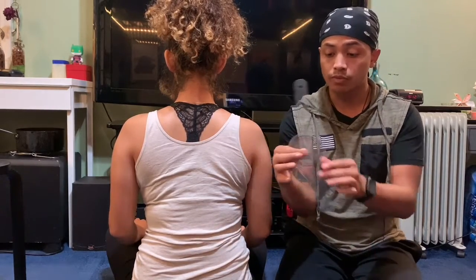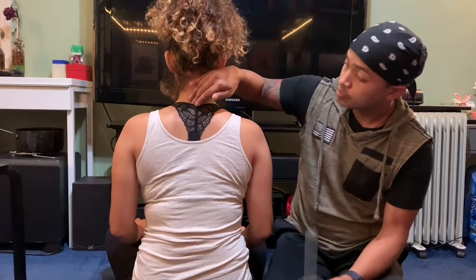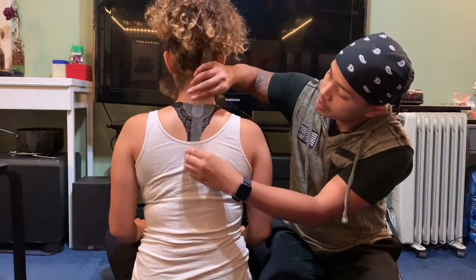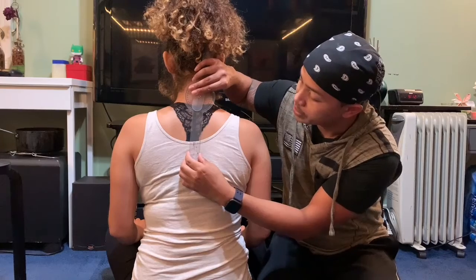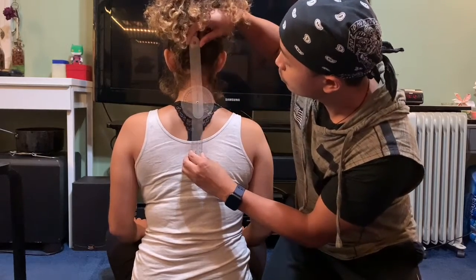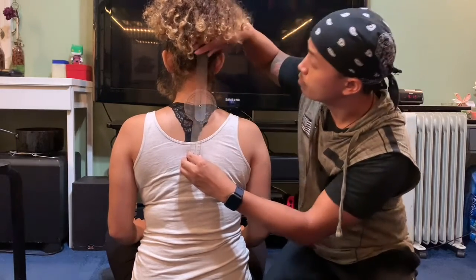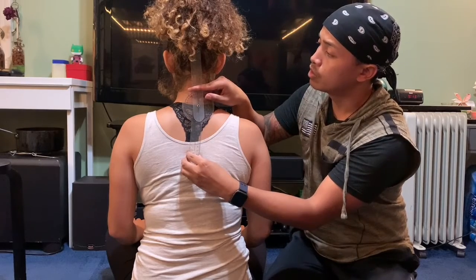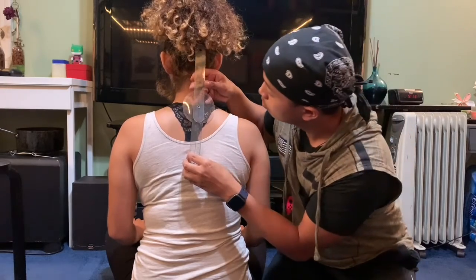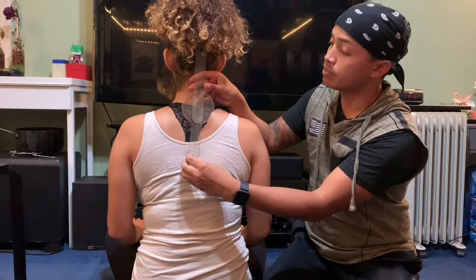I'm going to use this goniometer and I'm going to put the axis on C7 of the cervical, which is right here. The stationary arm is going to be aligned with the spinous process of the thoracic spine. The moving arm is going to be on the posterior midline of the occipital protuberance of the head. She's going to start at 180 degrees and I'm going to ask her to laterally flex her head to the right. Go ahead and flex.